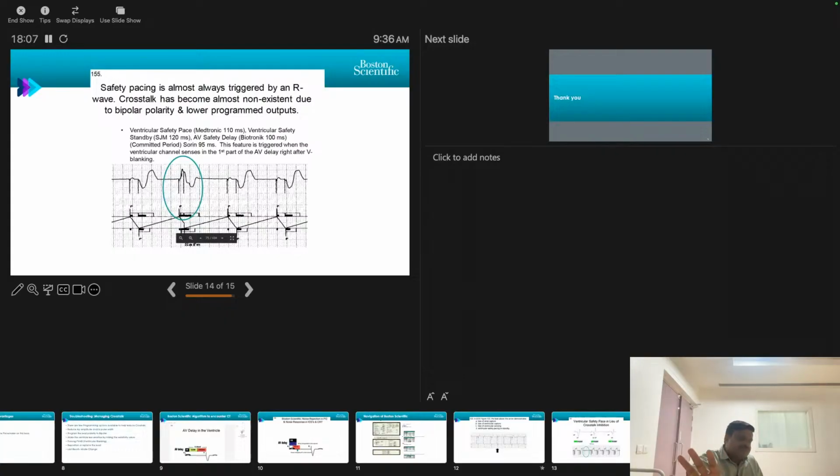Normally the device will look at the atrial pulse the majority of the time. In present generation, as per my understanding, correct me if I am wrong, if we switch on atrial auto capture for a particular patient, to confirm the atrial capture the evoked response is very minimal to the device.